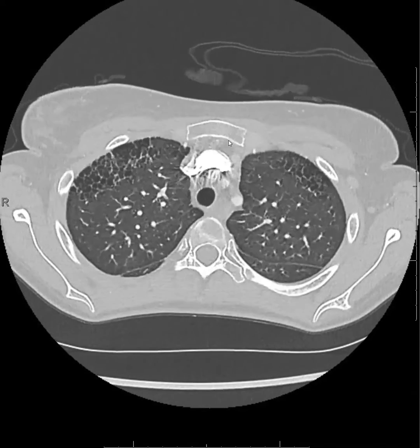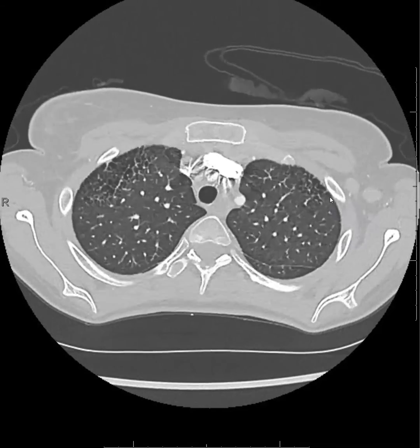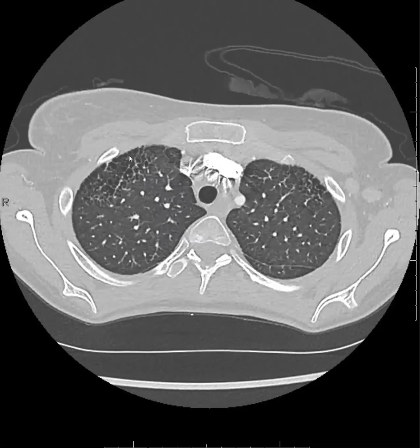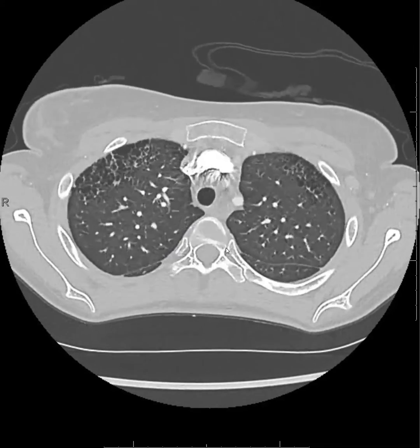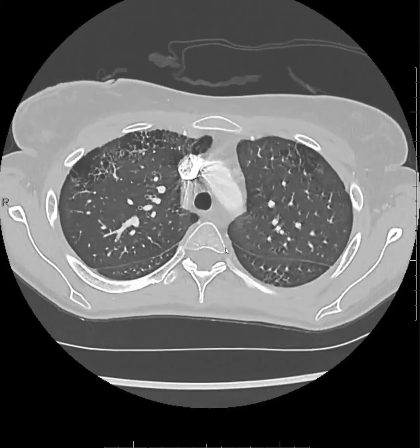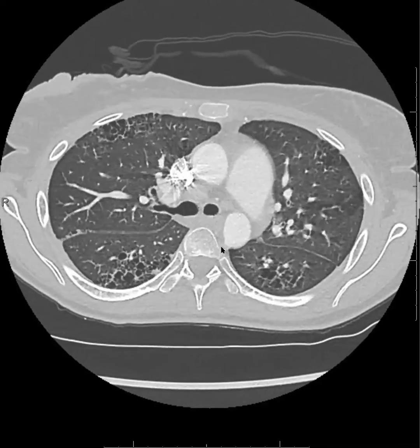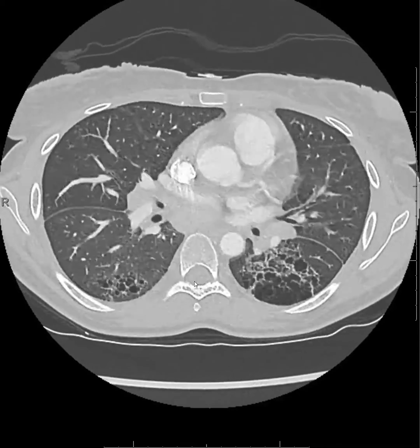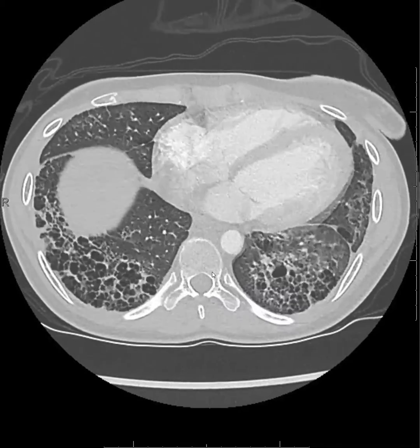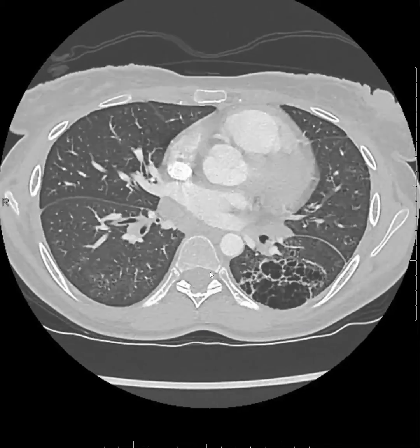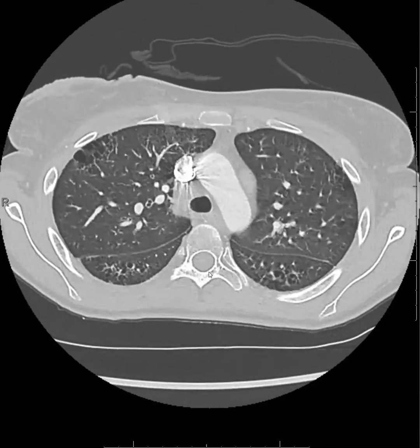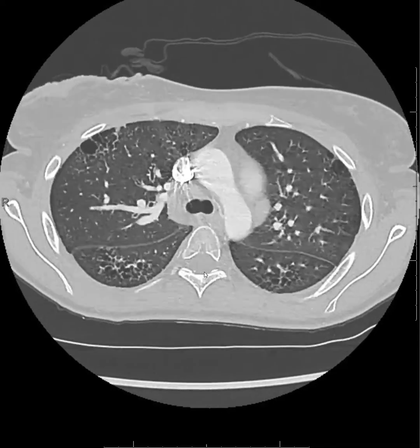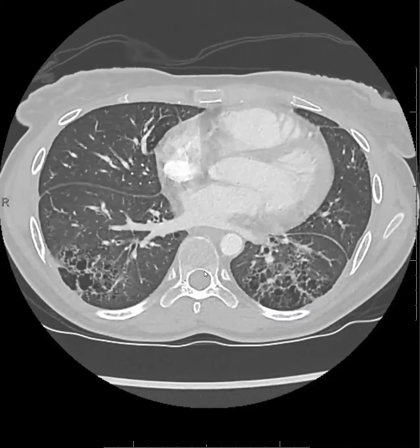Also, in the upper lobes there is an asymmetric predominance of pulmonary fibrosis anteriorly. That's another sign discussed in that paper called the anterior upper lobe sign, which in conjunction with lower lobe fibrosis findings is also associated with connective tissue disease rather than idiopathic pulmonary fibrosis, even when you have a UIP pattern.